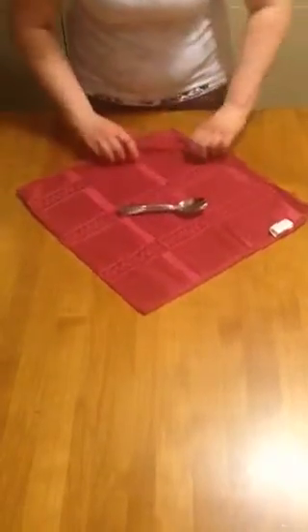Now I'm going to demonstrate with a smaller instrument. I have just a small napkin here and some spoons. You put that in the middle, you fold the top part over, and then you fold in the corners, again making a tab so the nurses are able to get it out aseptically.